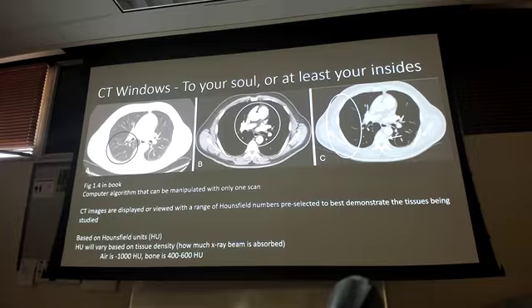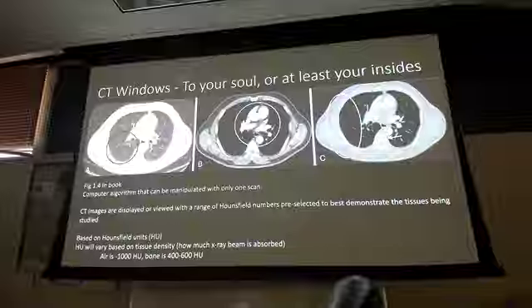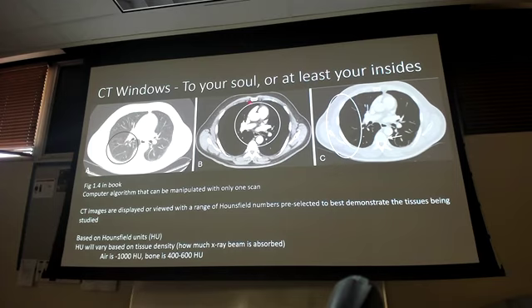Bravo is my soft tissue window. So now look at my lungs. They're all black. I can't really see that lung tissue because I don't care about it. I want to see the soft tissue. The heart really jumps out. This is with contrast, but I can see all the chambers of the heart and the ascending aorta and the descending aorta.